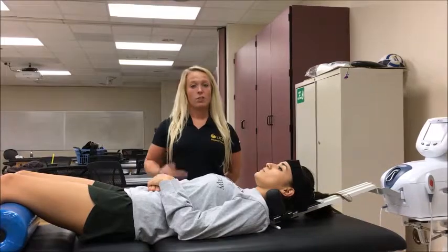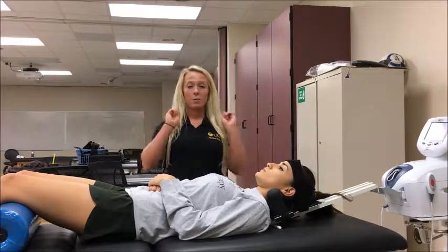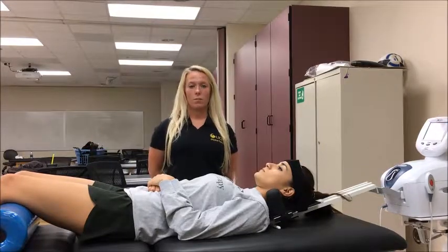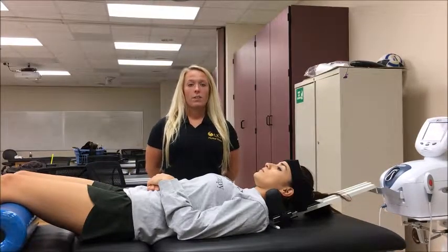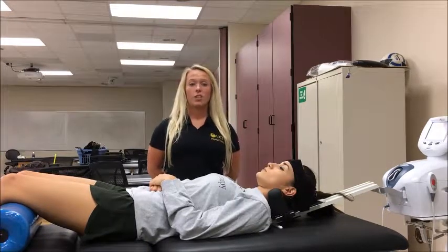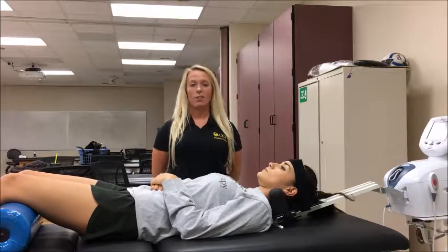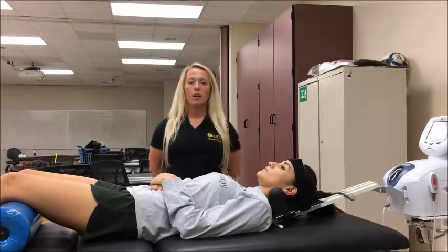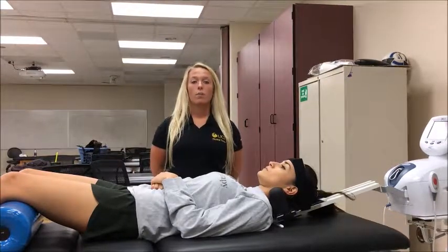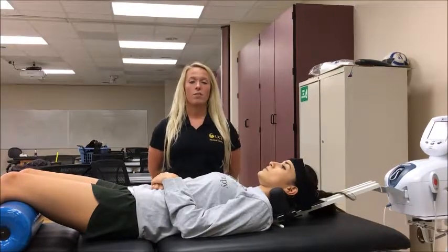My patient here has endured a whiplash injury from a car accident about a month ago, causing bilateral paraspinal muscle spasms in the cervical spine region. The benefit of using traction for this diagnosis is to promote relaxation of the paraspinal muscles by interrupting the pain-spasm-pain cycle, or by inhibition of alpha motor neuron firing from depression of the monosynaptic response or stimulation of the Golgi tendon organs.